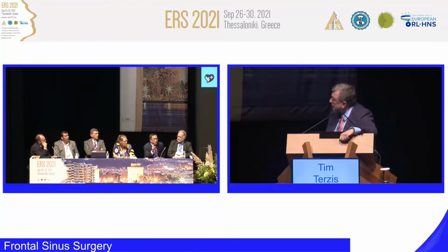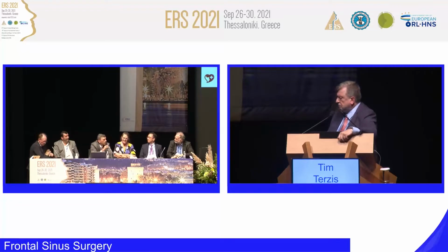Tim, may I ask a question as well? So when you expose that much bone using a drill, does anyone use any adjuncts to help that heal, like free grafts, free mucosal grafts? Or did anyone use stents, anything of that? I think this is a very good question, and I think this is pointing out the problem. So it makes a difference how we do the Draf 3 procedure also. I work with Wolfgang, I know how to do it, but the problem always is how to protect the mucosa in the lateral aspect of our drainage, in the posterior aspect, okay?